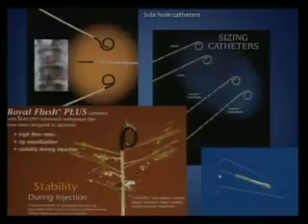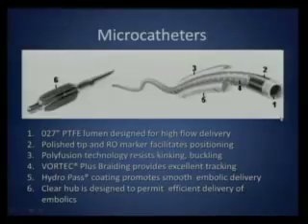This is known as a punch hole device. This is for making extra holes. So if you have a catheter in which you want to make extra holes, you can actually make extra holes in the catheter by doing this. Sometimes when you're doing adrenal vein sampling or venous sampling, if you only have one hole in the distal end of the catheter, you are not able to pull blood because it goes to the wall and stays there. You cannot aspirate. If you have another hole, aspiration becomes easy. So we have this now, we can make extra holes.